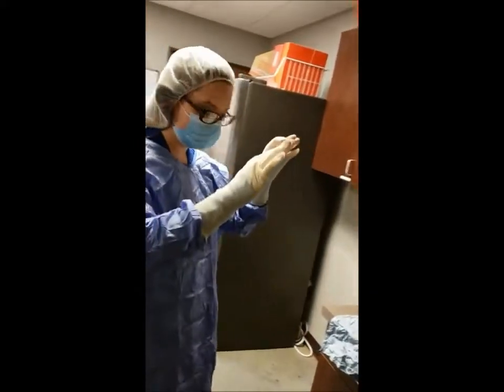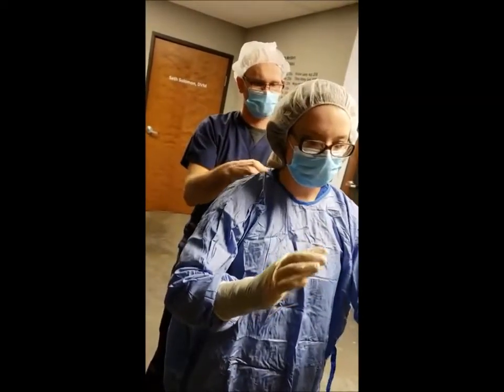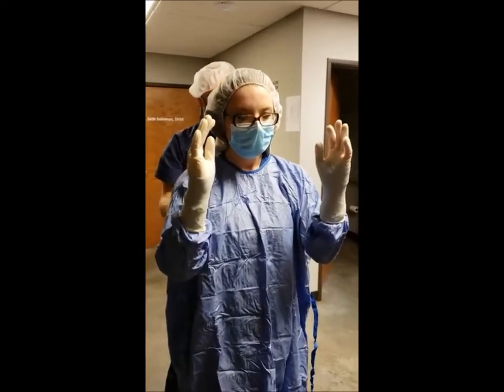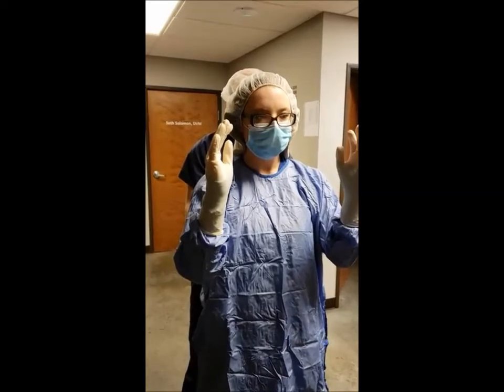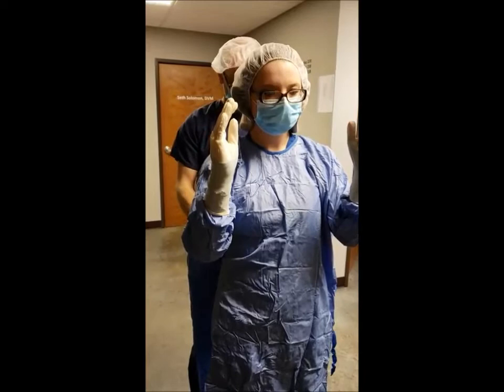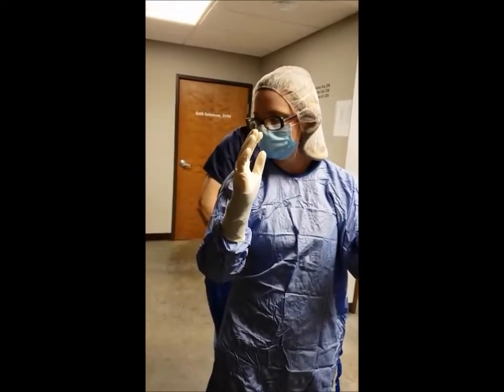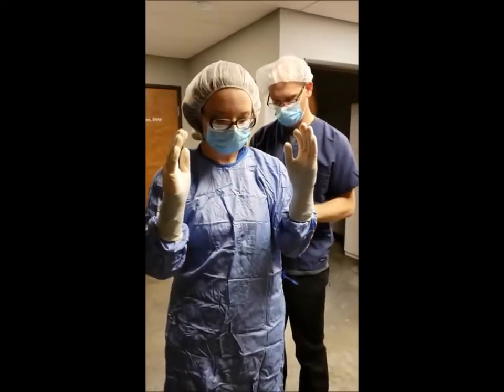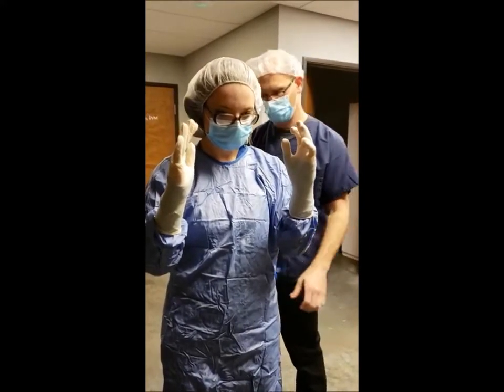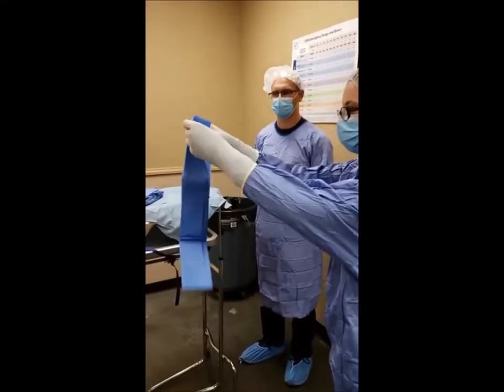And I'm going to have Dr. Schilling tie me in. And I want to make sure that I keep my hands, my elbows above my waist so that I stay sterile. Drape our patient.